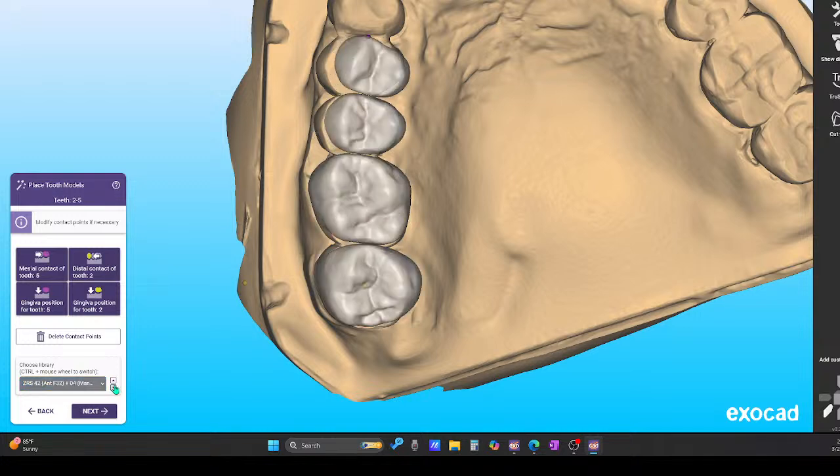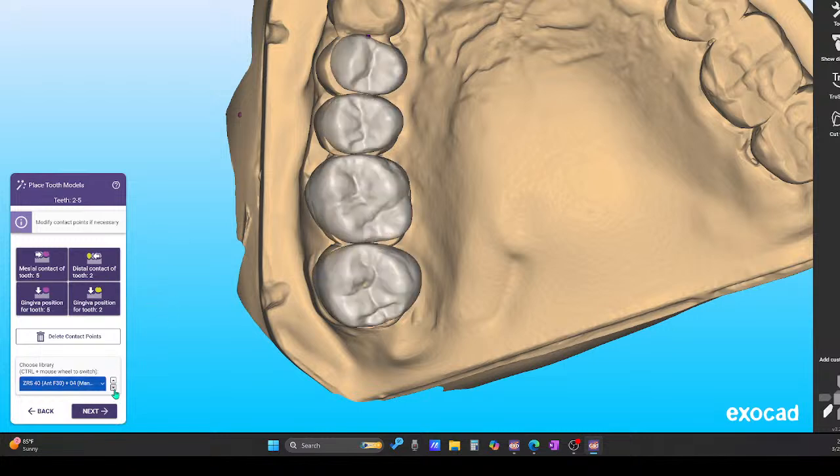Nope. And then, as you could see the outline of the tooth, like right here, it's missing, so the wax up is not gonna cover it. Again, can it work? Yes, but you're gonna have to spend more time dragging it and moving it all over the place. Find something that matches from the start, so you have less adjustments to do later. Just gonna improve your workflow.